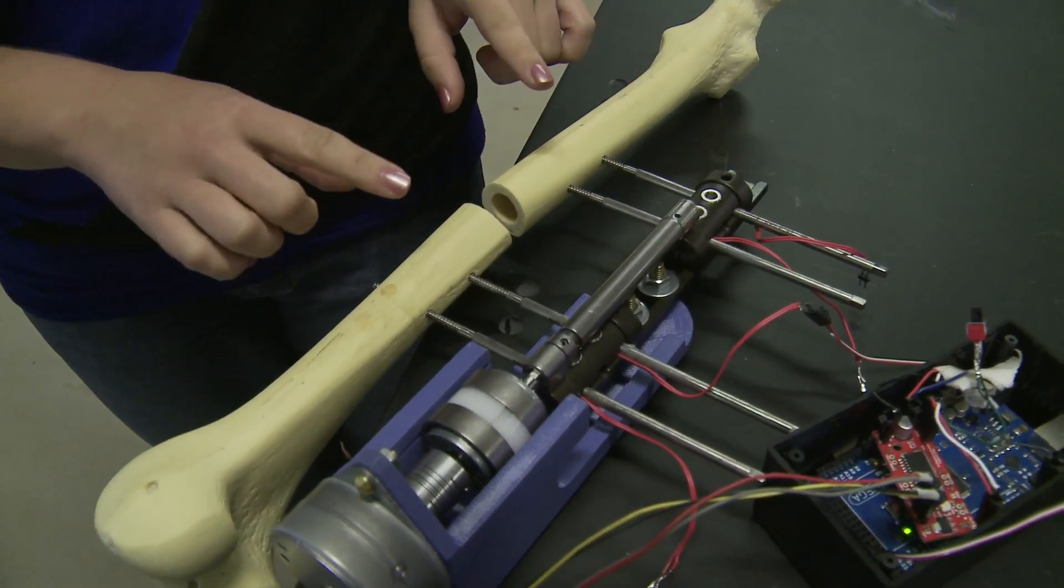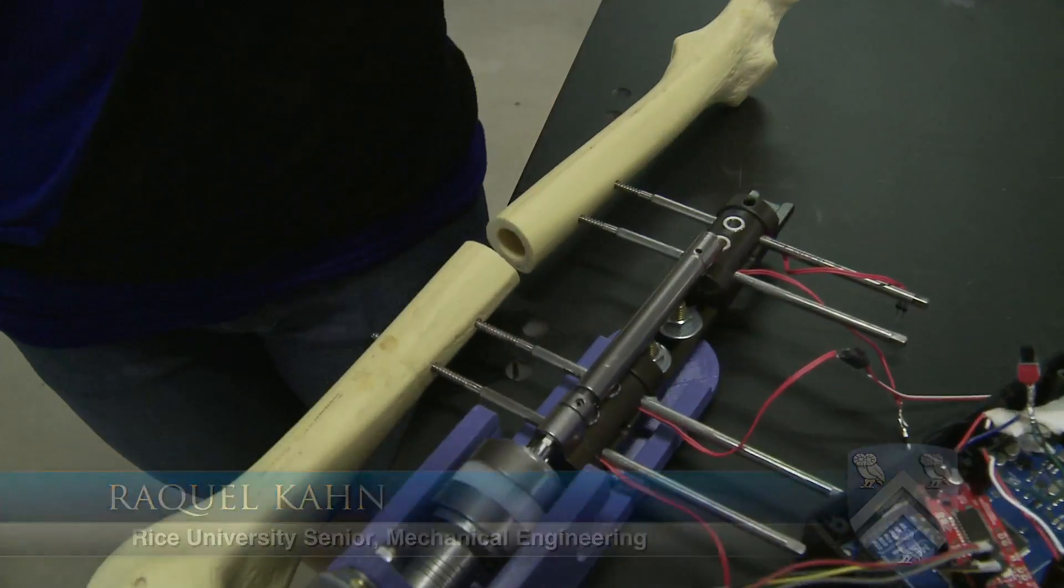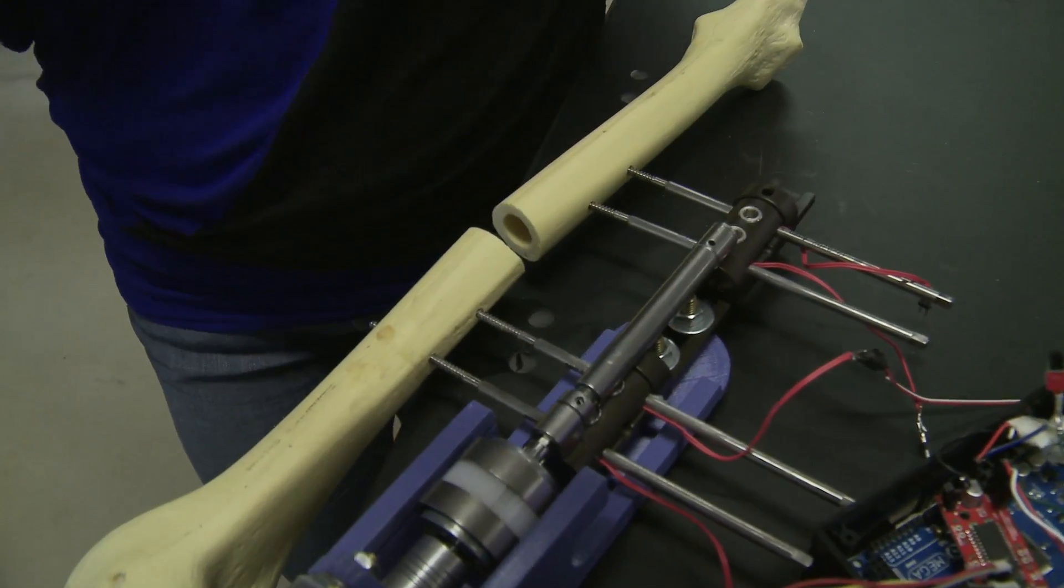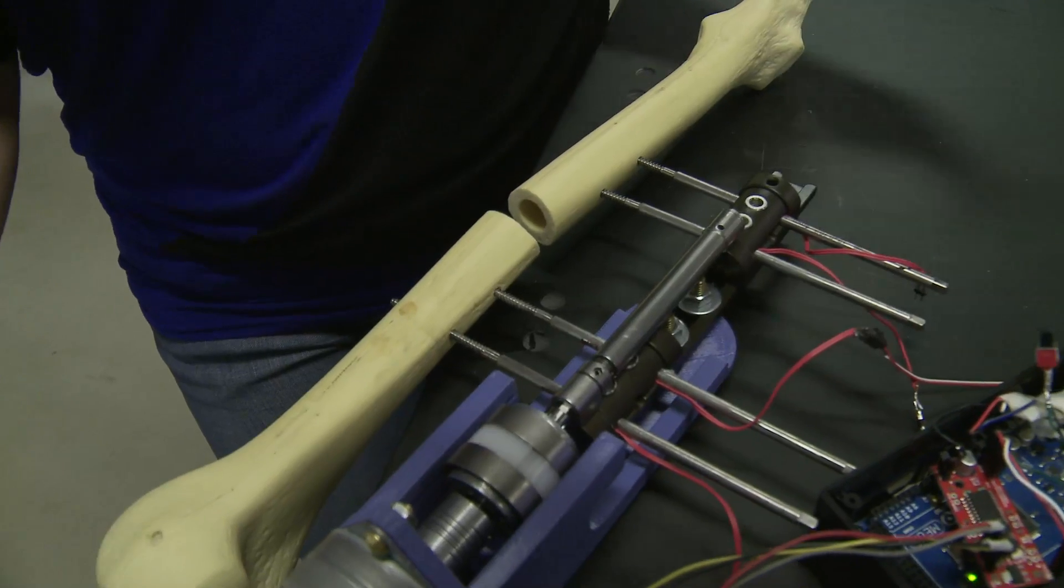So what you're seeing here is what we're modeling as a leg bone. Say this leg bone were shorter than the other of your two legs, you would want to do this procedure. It's called distraction osteogenesis, but basically that's just to make the leg longer so that it's the same length as your other one.